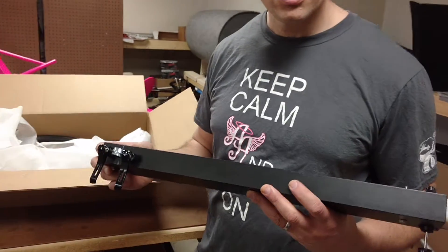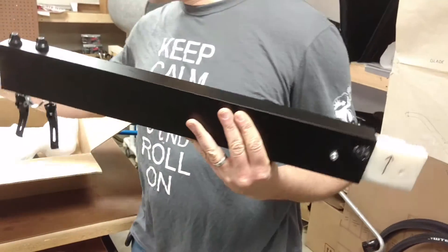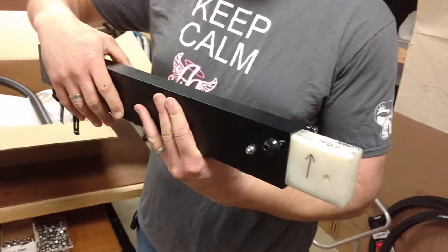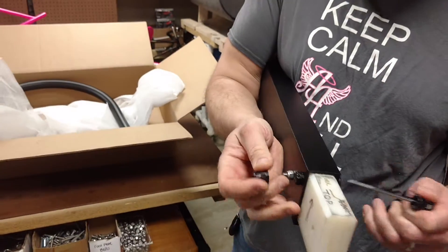This is how you'll receive the adapter in the mail, along with the bike boom. You have to take out the quick-release pins. I'm going to do that now. Just put them aside for now.